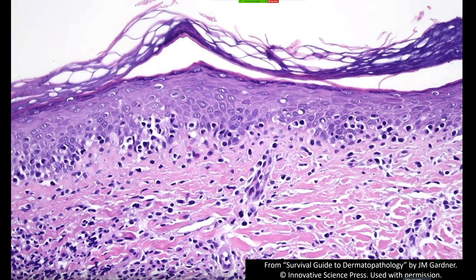Unless they're really obvious, I find it challenging to evaluate atypia personally. As for cerebriform, crinkled nuclei — I can find something that looks cerebriform in almost any skin biopsy with lymphocytes. What I rely on more is the architecture, combined very importantly with the clinical context. If something looks like mycosis fungoides microscopically, it really has to fit clinically — the history, the appearance — which is why it's often very difficult to make a definitive diagnosis without complete clinical information.